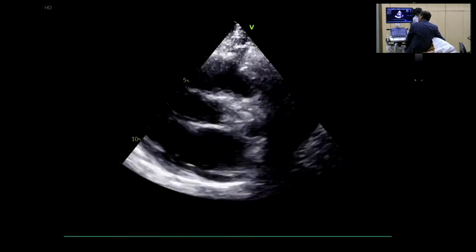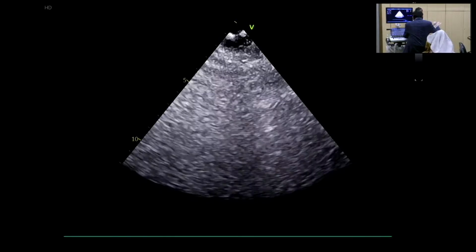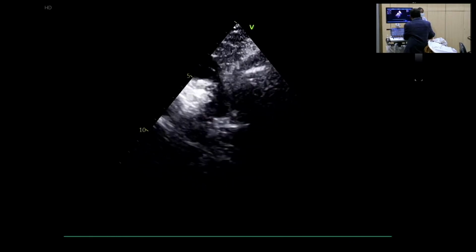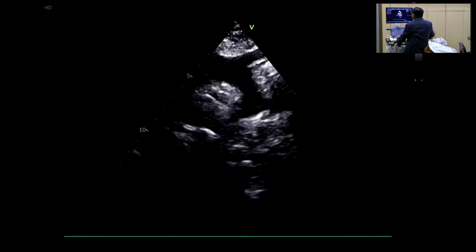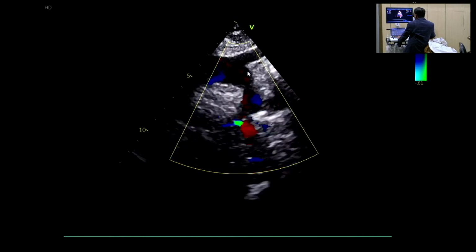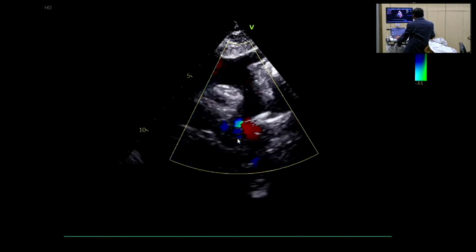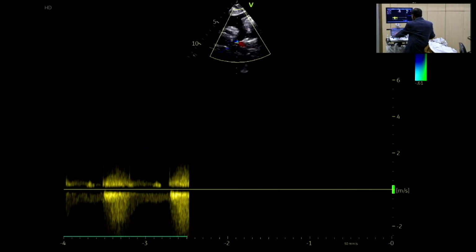Aortic valve, I am not sure till now. Okay, let's go to the arch straight. See the function is good. LVH is there. So she must be having significant hypertension. उधर देख लीजिए. In fact, she came with hypertension. Okay, okay. So this is the suprasternal view. We all are seeing this, and then you see this. But the best clue was descending aorta. Start there.